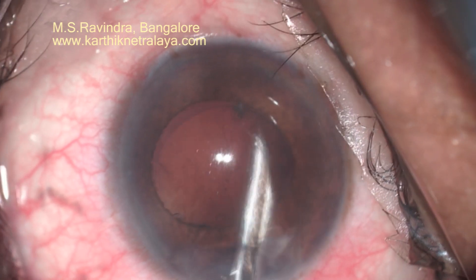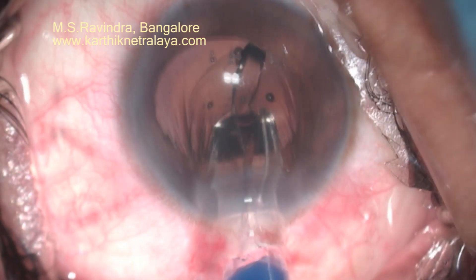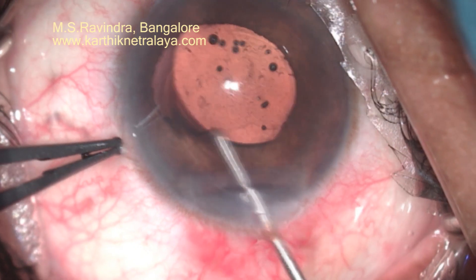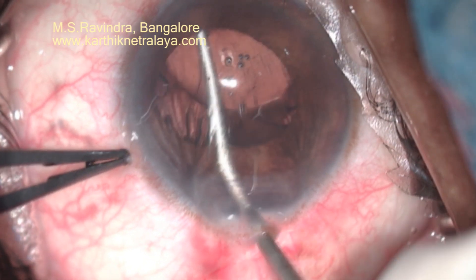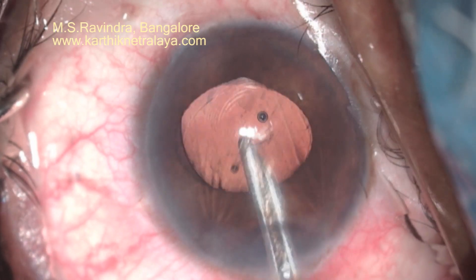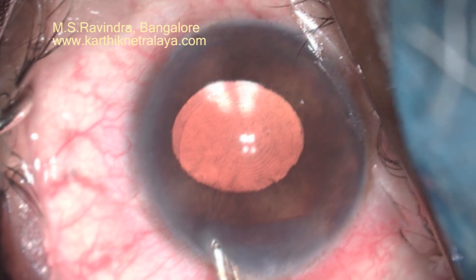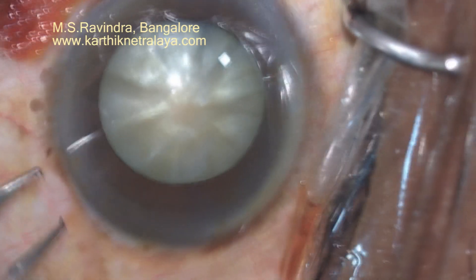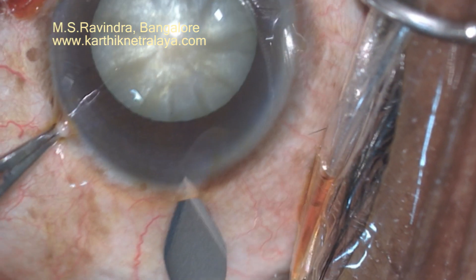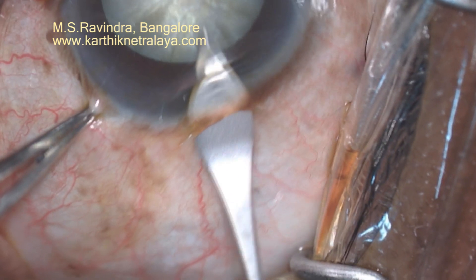As the cortex has lost its fibrillar architecture, we need to go to every quadrant of the capsular bag to remove the leftover cortical pieces and chunks of cortex; otherwise you will see them in the postoperative period. Viscoelastic is injected into the capsular bag. In this case we have a multifocal lens, and complete viscoaspiration needs to be done to minimize postoperative inflammation. Even a small amount of cortex in the anterior chamber or in the capsular bag will give rise to chronic inflammation and scarring of the capsular bag.